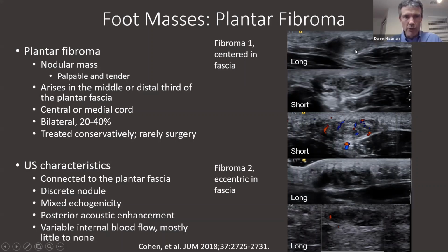They are a discrete nodule, mixed echogenicity. They often have posterior acoustic enhancement, which is very interesting, given how dense and fibrotic they are. And they have variable internal blood flow, mostly little to none. So here's a little bit of blood flow, almost no blood flow.